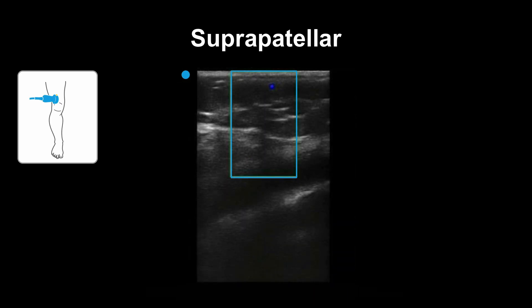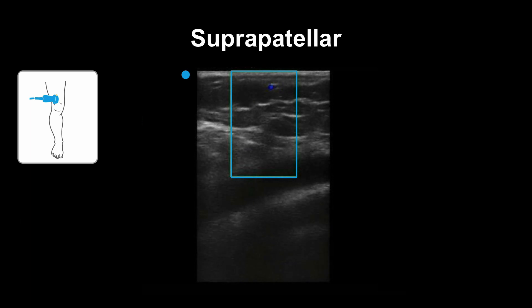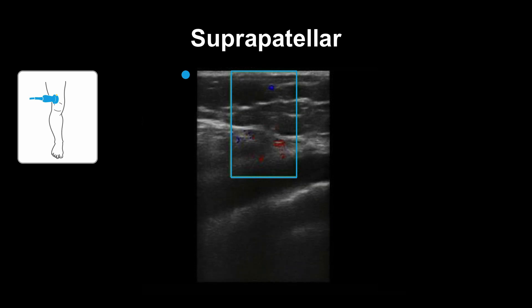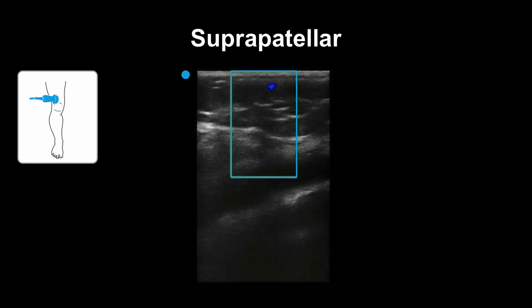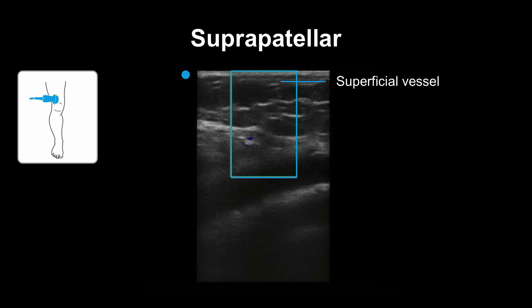Once you've found your pocket, another important consideration is to look for structures in the path of your needle. What do you see here? It's a superficial vessel.